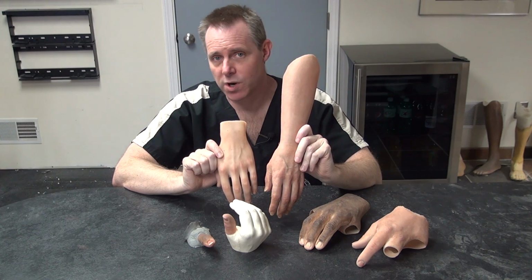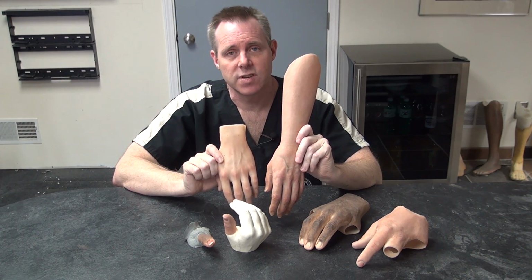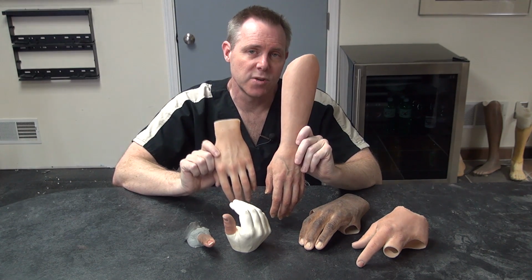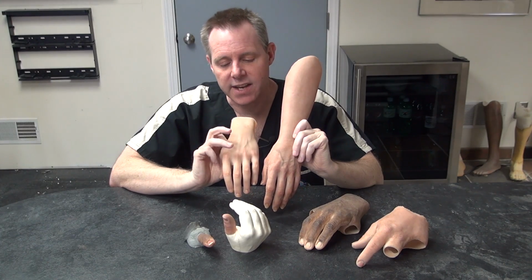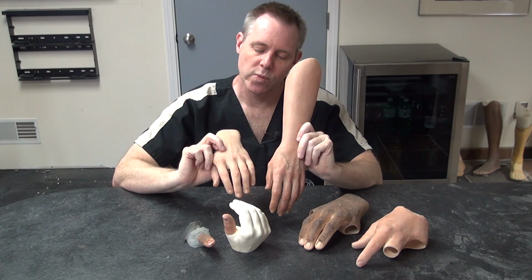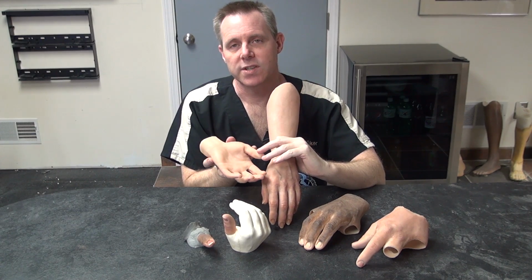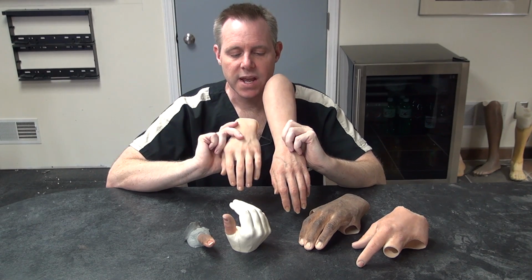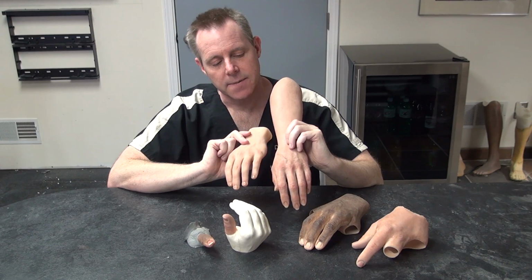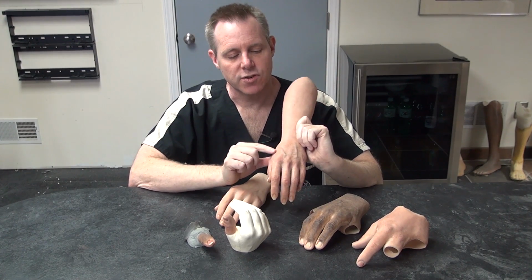Sometimes the shape and the design is really important, and you don't want to sacrifice the function, or you want something that can accommodate an unusual shape, and you can't always achieve that with a life cast. This is a life cast here, which is nice because it creates a more realistic surface texture and details. It even has fingerprints. All of these have custom nails to match a patient, so we can put in an extraordinary amount of detail. This is actually an older demo, so it is all externally painted.